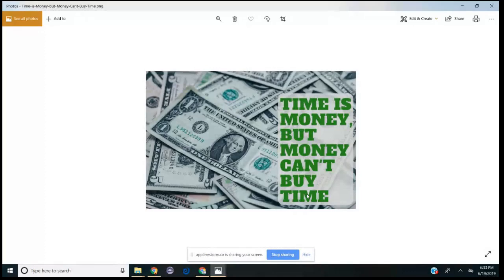They did an AR over the lens. They sat the patient in the room. They let him look through the AR, and the AR gave him 20/20 vision. It was unremarkable. He then said, great, can I leave now? And I said, sure, but the next lens I really need to refine and I need to work with you. His lens came in. I based all the scleral lens data off the Eaglet scan. I based the central vault off the Eaglet, and I based the over refraction on the AR that I took, and it was wonderful.